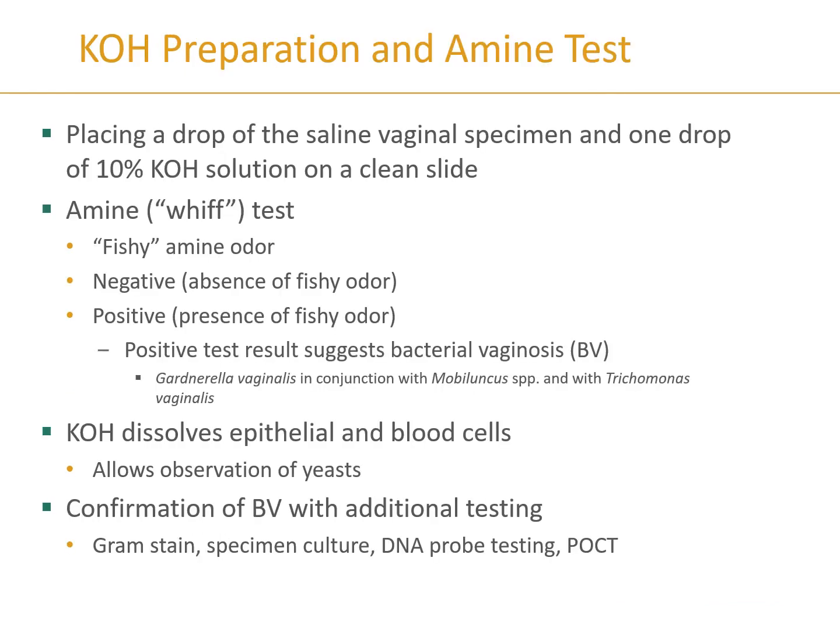So to perform a KOH prep, which may also be known as an amine test, you would place a drop of your sample, or roll your vaginal swab onto your slide if this was being done at bedside, and you would add 1 drop of your 10% KOH. I think the bottle says a minute maybe. You do want to give it just a few seconds to actually dissolve.